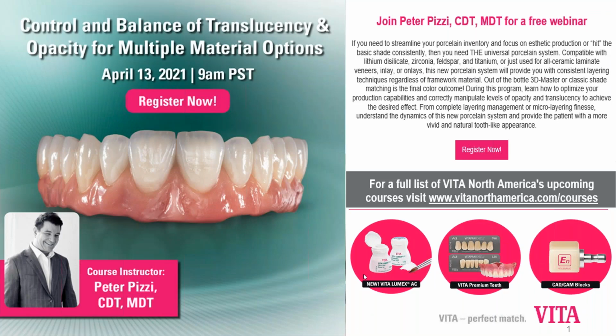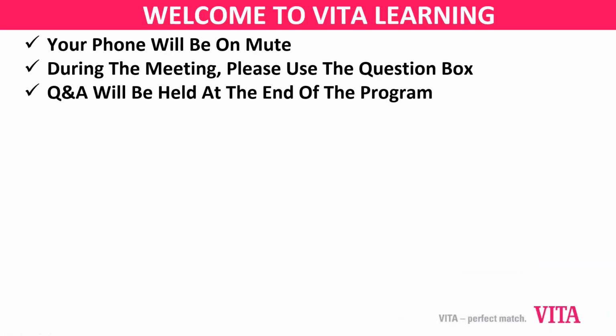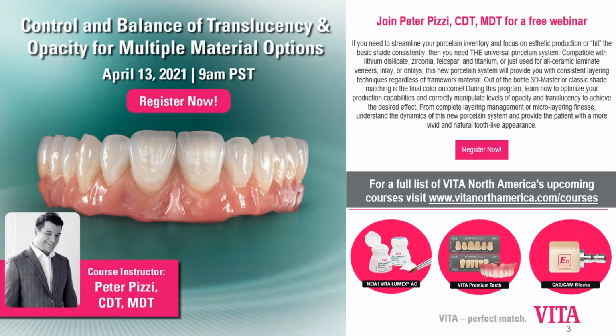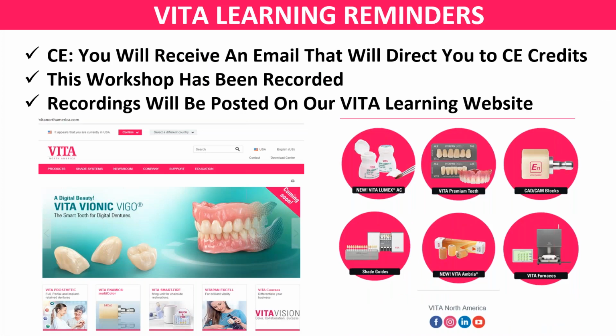So you could use either, honestly. It really depends on which one you're more comfortable with. And I think the only thing I'll add to that, Jim, is if I'm doing a lingual zirconia, where it's full lingual, and I'm gonna put some materials on that facial, I will definitely add either a violet or a gray blue into the material around that incisal third of the tooth, again, to create the depth. So I'll cheat light a little bit by trying to make it appear more translucent in that area.